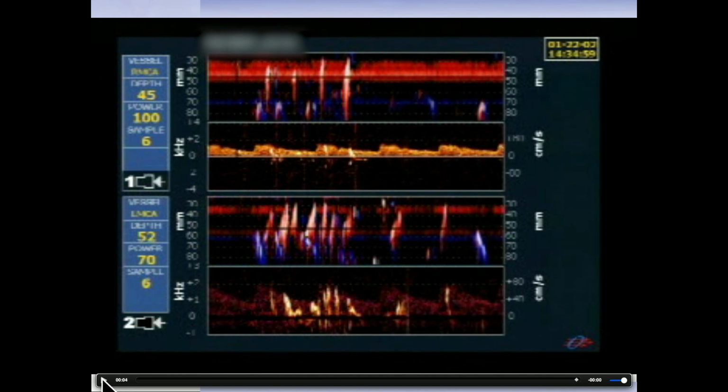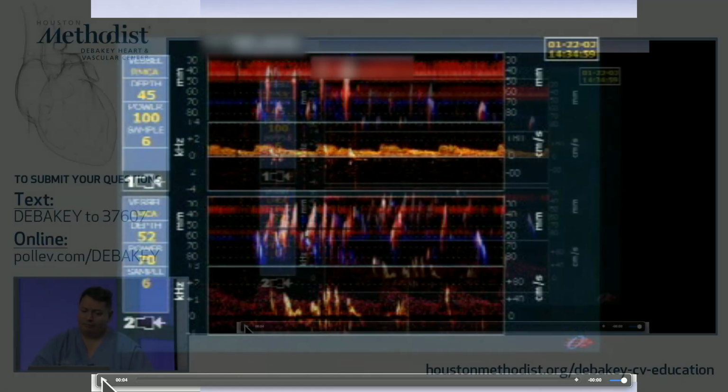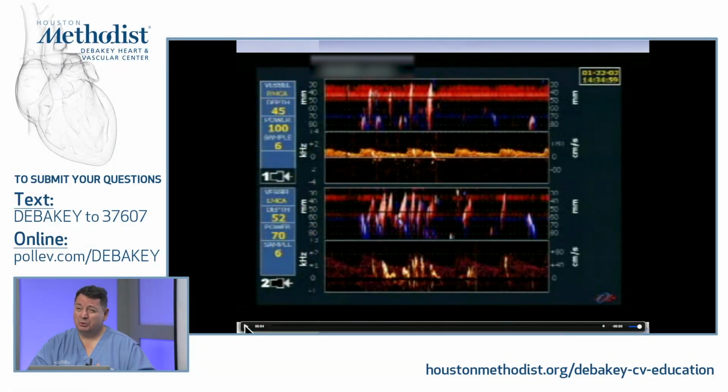And I really like to do bilateral monitoring, because if you have bilateral monitoring, you don't need to double the unilateral side. Some people do unilateral detection, but if you have one or two bubbles and you miss them, then those will be another false negative study. So when you do bilateral, you double your chances of catching those one or two bubbles.